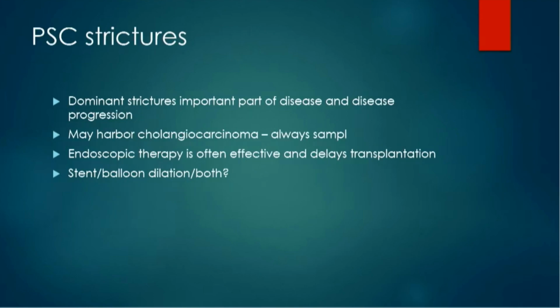Just a few words on PSC strictures to finish off. The dominant strictures are an important part of this disease, and endoscopic therapy has been shown to delay the time to transplantation. And then the question is whether we stent them or balloon dilate or even both.